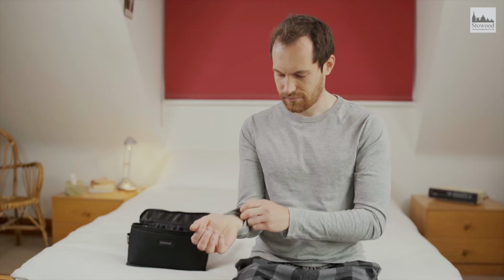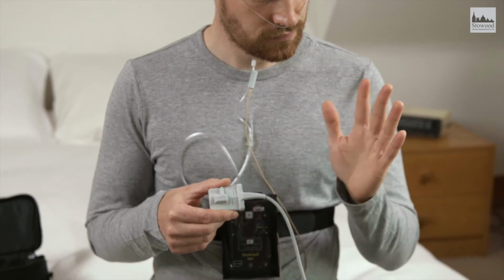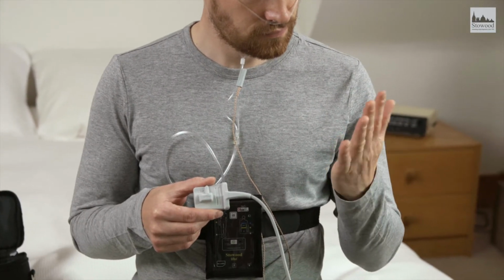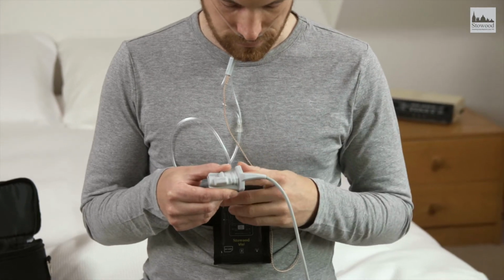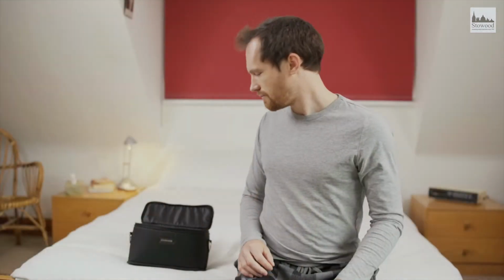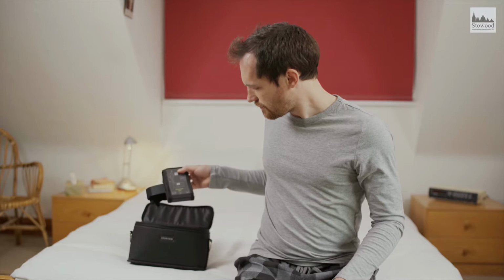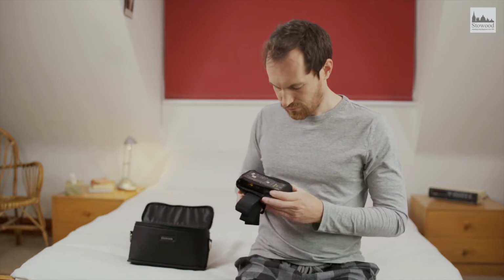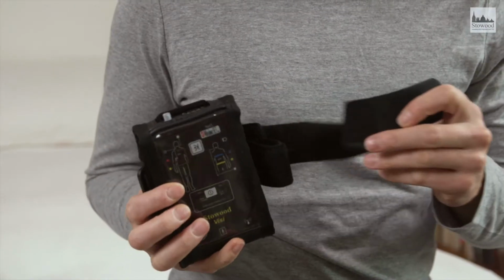device. Wear sleepwear with long or elbow-length sleeves over which to fit the device. If you have any nail polish, lacquer, or nail extensions, you'll need to remove them from one finger later in the process. So please get whatever you need to remove the material now. We'll tell you which finger you need to clean later in the instructions. Before lending you the device, your clinician will have checked that there are fresh batteries in the sleep recorder.